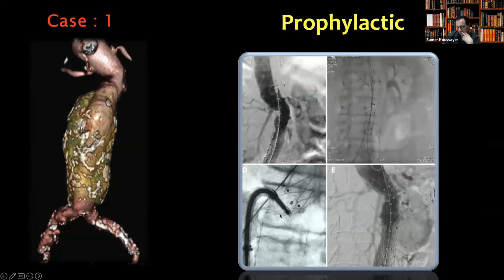Because if you go down, again, always be afraid you are far, maybe the aorta is here. The only time the aorta is very close is in this area here, because it's your neck. So you put them very close. See the tip, they are here.